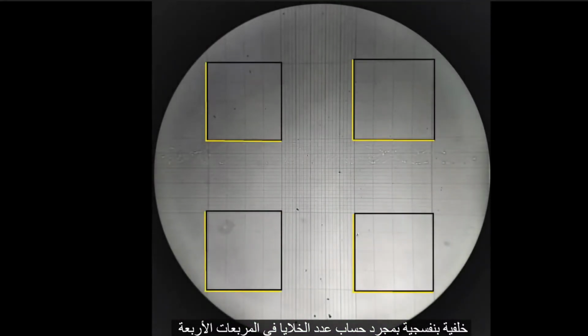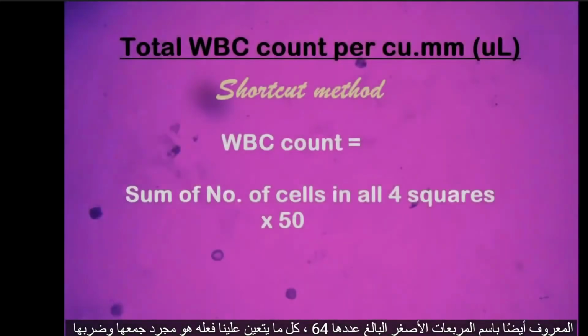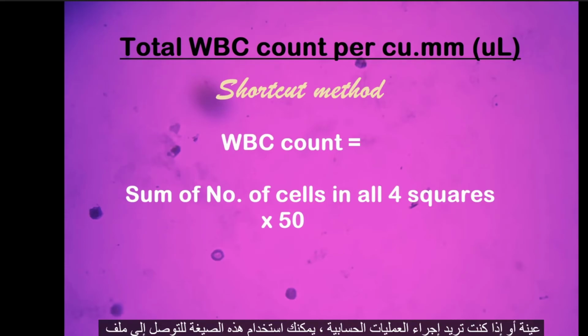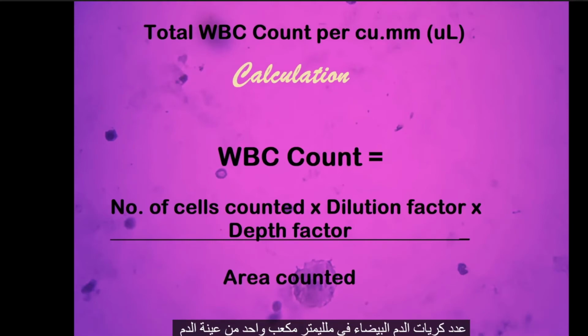Once you've counted the number of cells in the 4 squares, aka the 64 smaller squares, all you have to do is just add them up and multiply the sum by 50. This gives you the total WBC count per cubic millimeter of blood sample. Or if you want to do the math, you can use this formula to come up with the number of WBCs in 1 cubic millimeter of the blood sample.